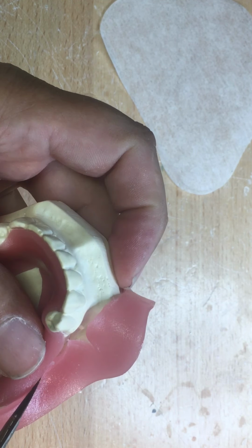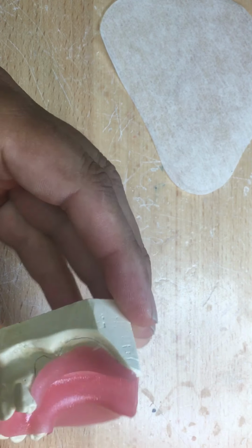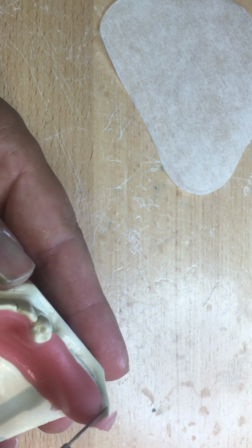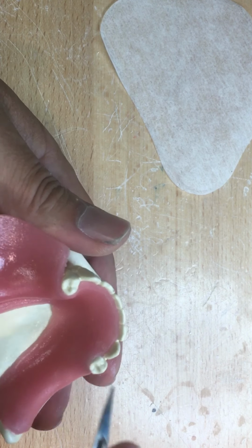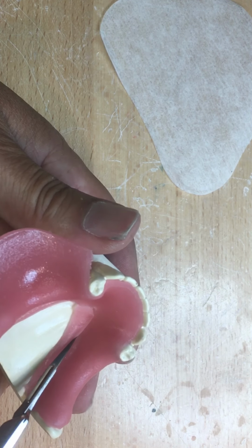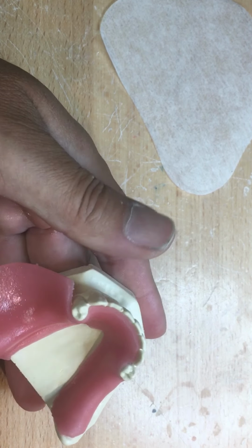Now, as you can see, I'm cutting this well short of my borders. I'm not trusting the dentist's alginate here, because I know they didn't take a custom tray that fully replicated the length. And the last thing I want is to overextend and cause any pain to the patient, or the occlusion rim to, let's say, spring or bounce up, creating an inaccurate registration. Remember what I'm using this for: to register vertical dimension, whether it's centric relation or centric occlusion. That's it.